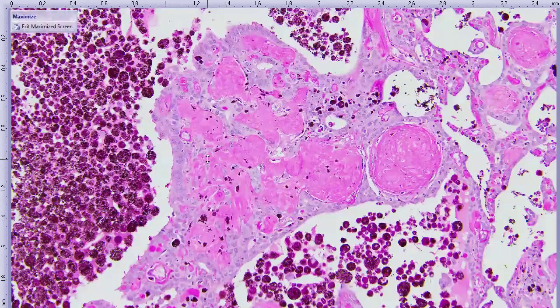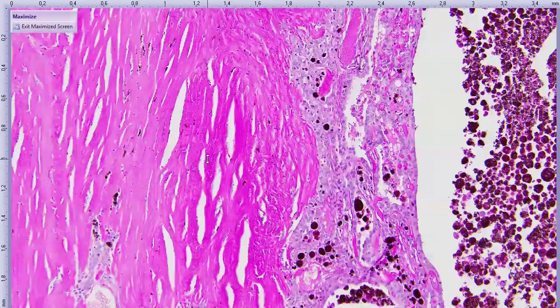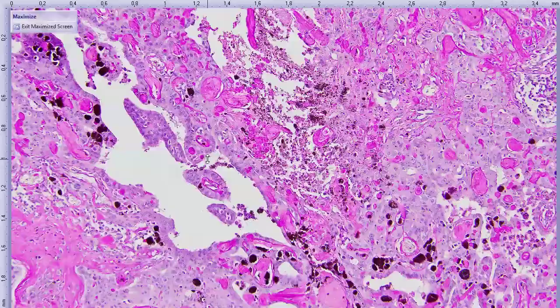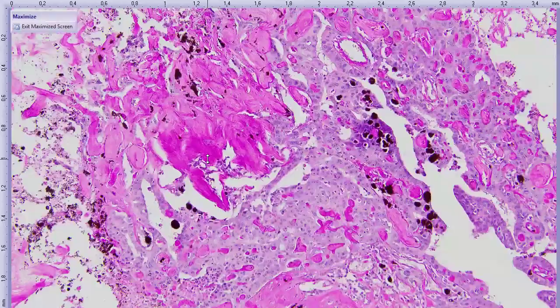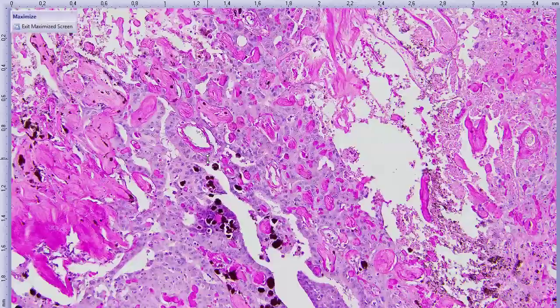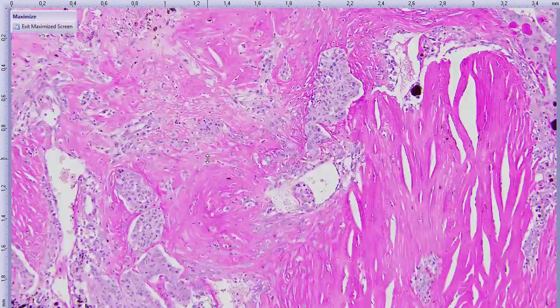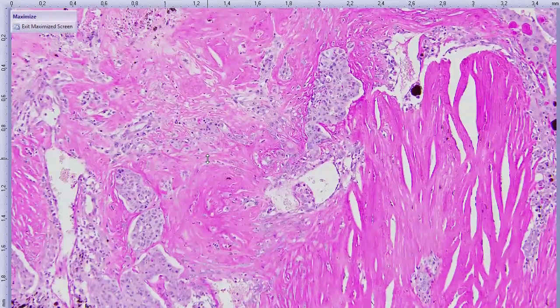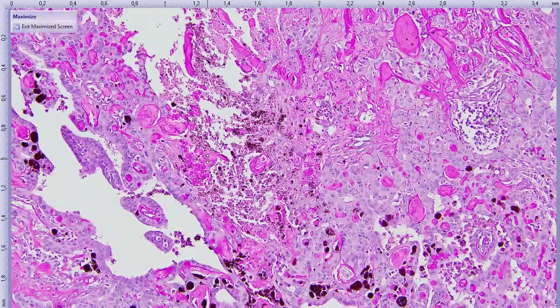That strongly suggested, and helped nudge us towards, our differential diagnosis of a tumor of iridociliary origin, right? But this is no mere iridociliary tumor. This is what we classified as a pleomorphic adenocarcinoma, right? These are truly malignant neoplastic processes of the iris and ciliary body.